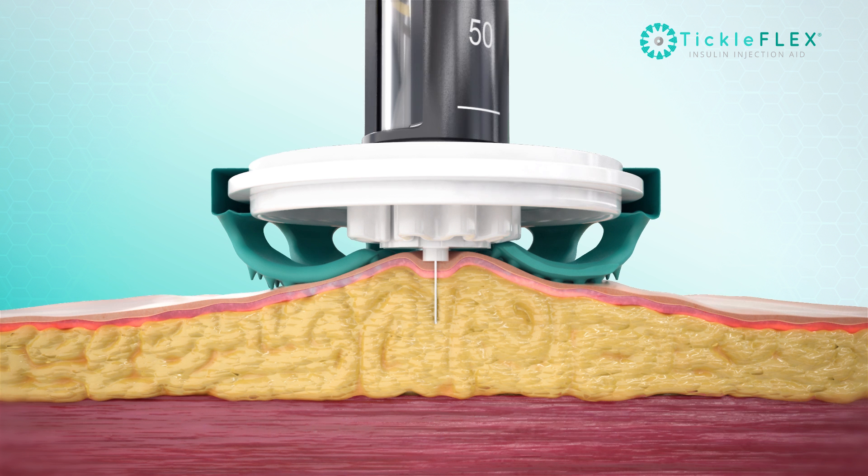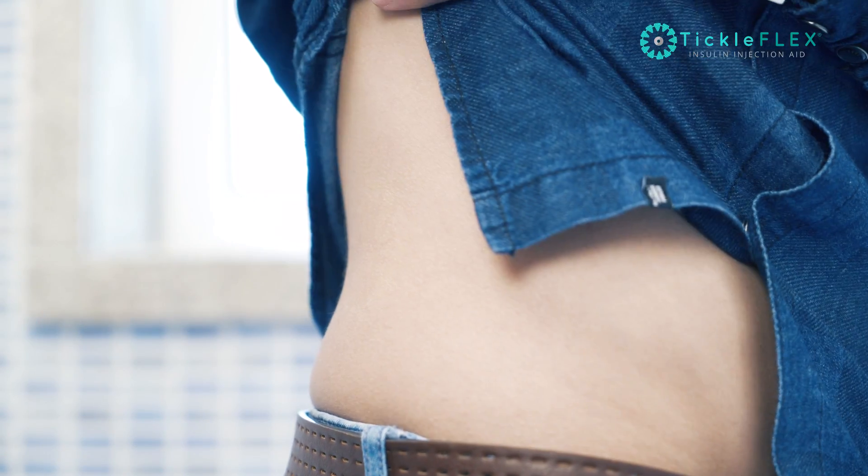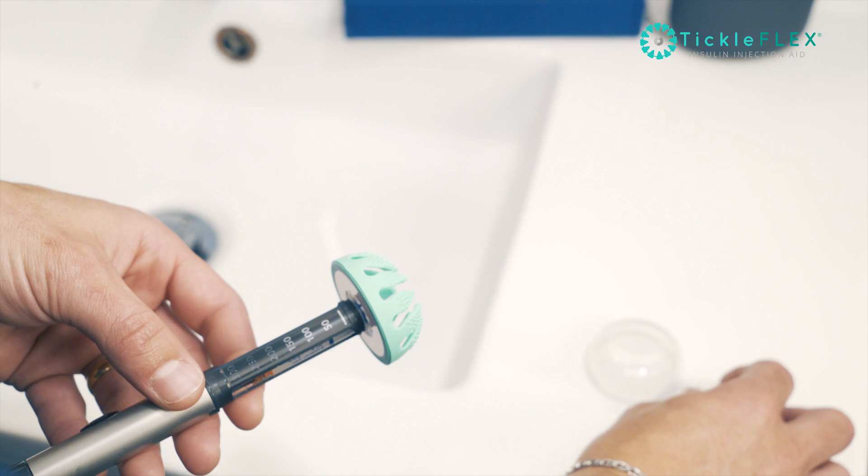Whilst at the same time securing the skin, preventing needle shear as a result of an unsteady hand. With Tickleflex, you can now reach further around your body with one hand.